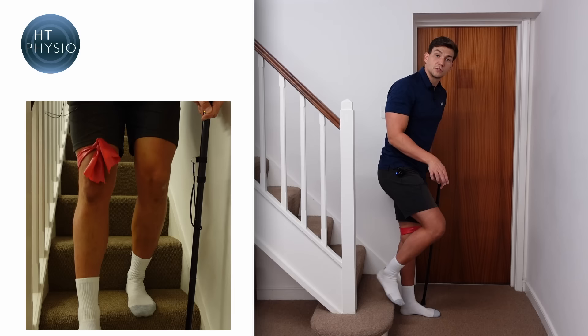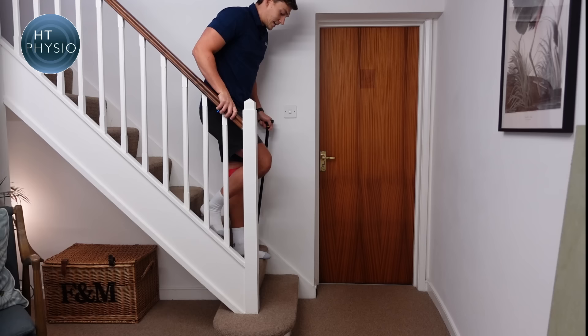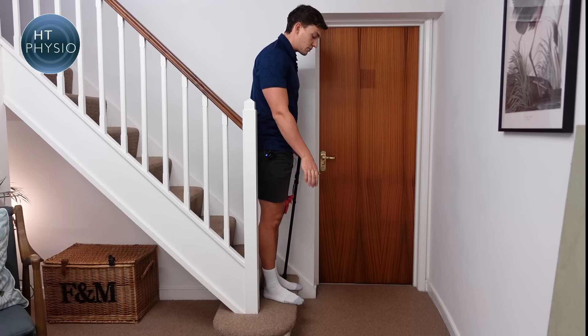Here's the descent sequence over a few steps: hand on the handrail, stick comes down, bad leg, then good leg. Repeat — handrail, stick, bad leg, good leg — for each step. And that's how we descend stairs safely.